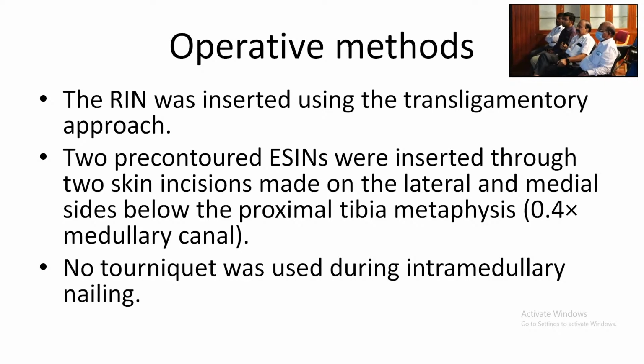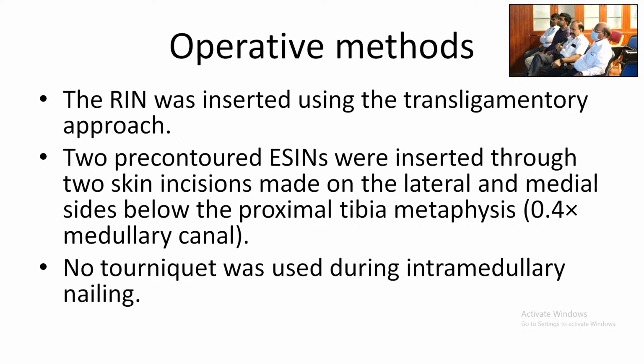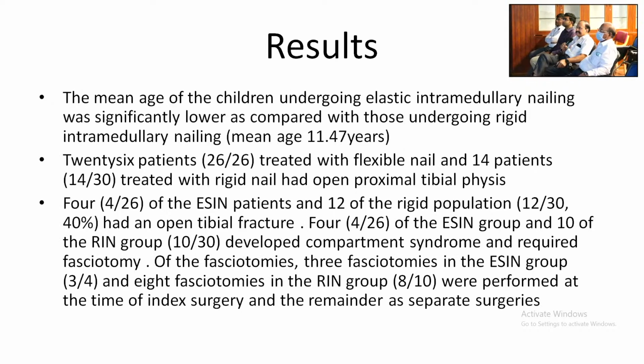Medial side below the proximal tibial metaphysis, that is 0.4 into the medullary canal. No tourniquet was used during the intramedullary nailing, sir. Results: the mean age of the children undergoing elastic intramedullary nailing was significantly lower compared with those undergoing rigid intramedullary nailing.